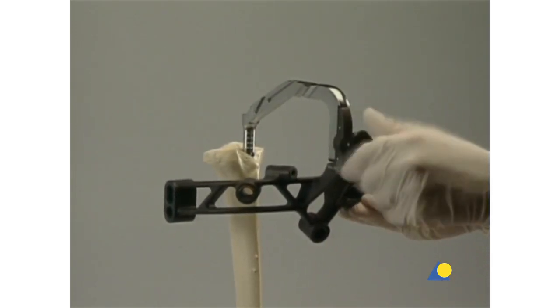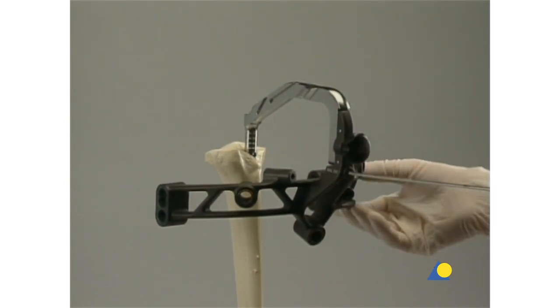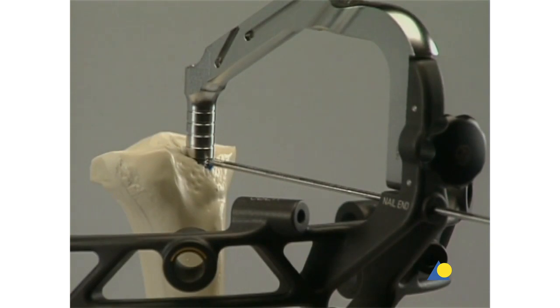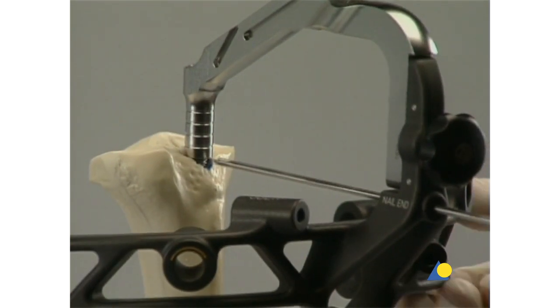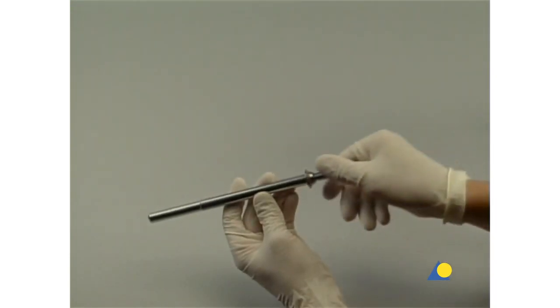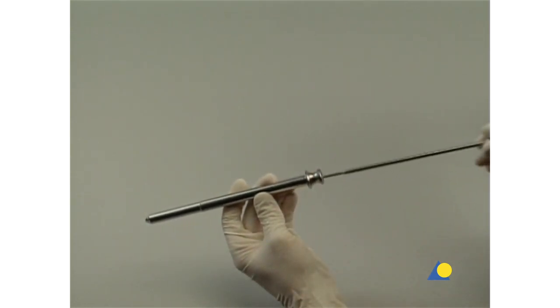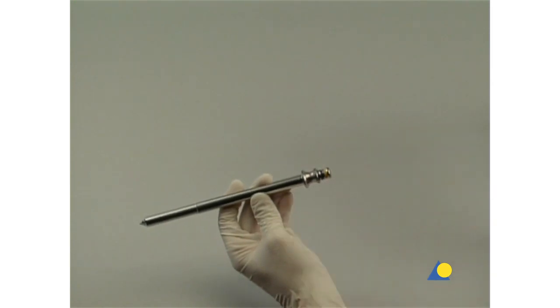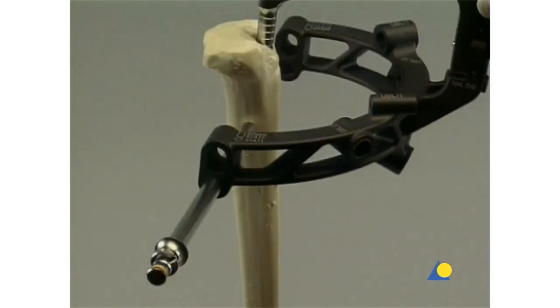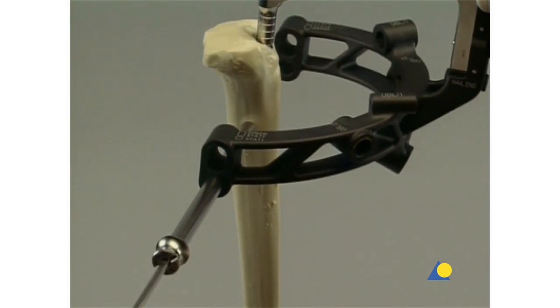The aiming arm is attached, and a 3.2 millimeter guide wire is inserted. The tip of the guide wire indicates the exact proximal position of the nail in a medial lateral view. The three-part trocar combination — consisting of the corresponding protection sleeve, drill sleeve, and trocar — is inserted through the medial lateral hole in the aiming arm. The trocar is inserted down to the bone through a stab incision, and is then removed.